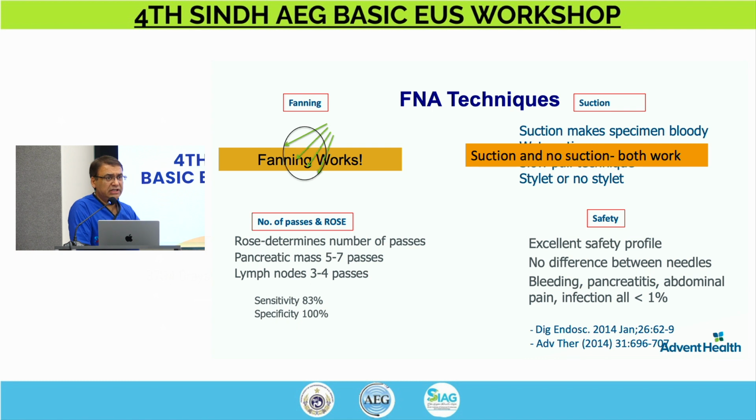Stylet, I don't use it. The needle comes with the stylet inside, so I will use that in the first pass, but after that, I don't need it. But sometimes people use a capillary technique, which means when a stylet is in there, it's a little bit pulled back. So when you are going into the mass, your tech is pulling the stylet back. The concept behind that is it creates a negative pressure in the needle, so it helps you pull the tissue in there. So yes, that might work, might not work.